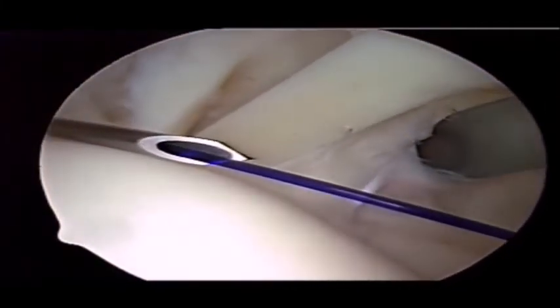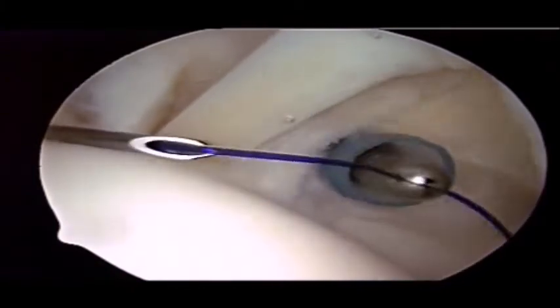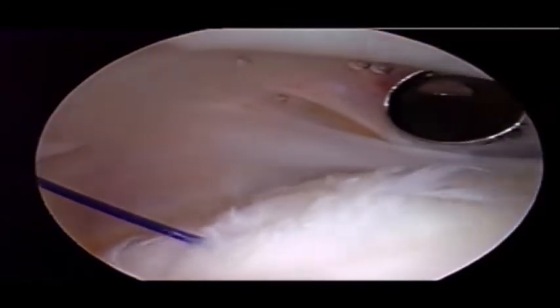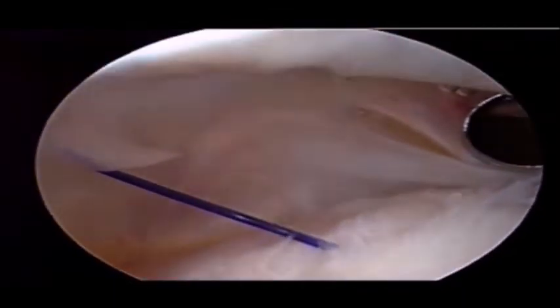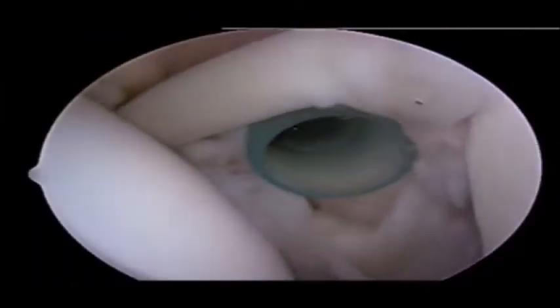Using a marking suture here to identify the adjacent bursal rotator cuff tendon surface helps us to recognize whether there are bursal changes, and we can see that there is not. And in fact, this tendon tear would be very difficult to identify if not for recognition of the bellows.